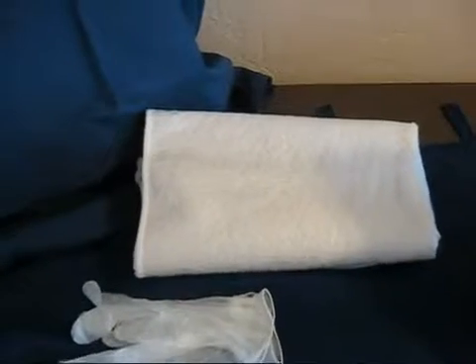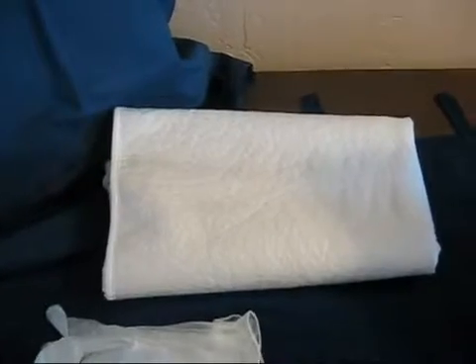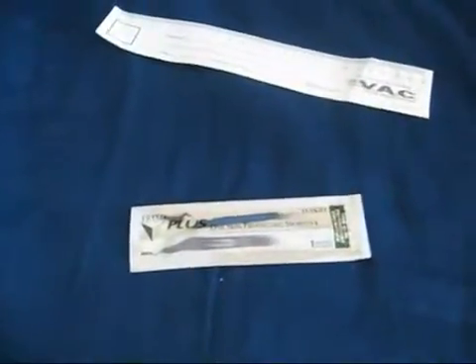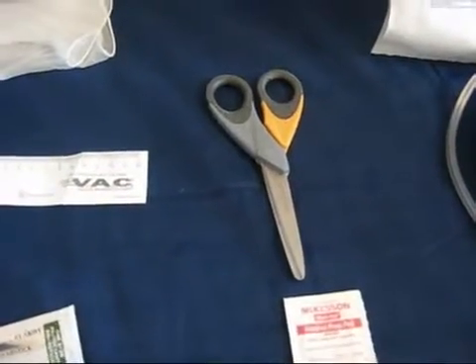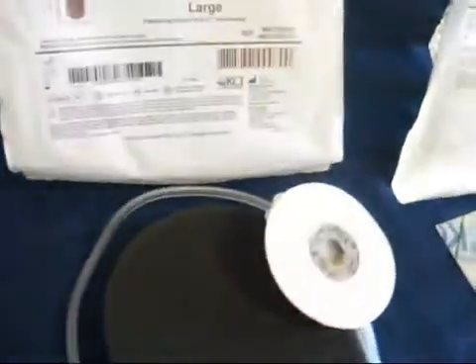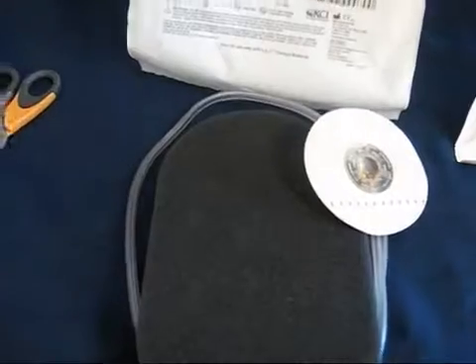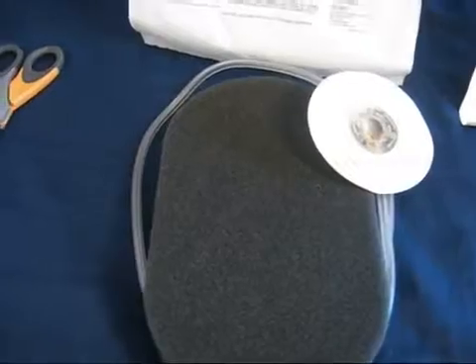In order to apply a wound vac, you will need to have a moisture-proof barrier or a chuck, your gloves, a metric measure to measure the wound, some skin prep, scissors and alcohol. Make sure that you clean your scissors very carefully in between each dressing change. And you will need to get your sponge also. This is a granuform sponge, and it comes in black, white, or silver. Check the doctor's orders to make certain you get the right type.